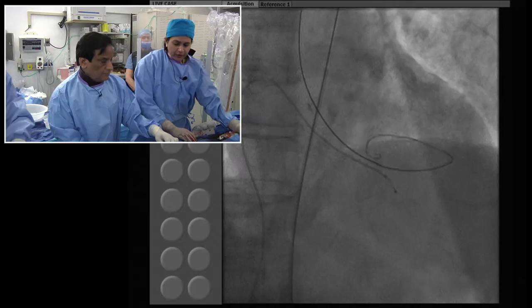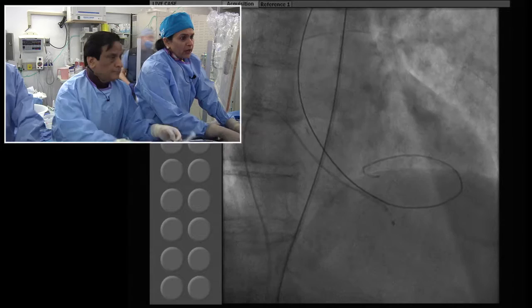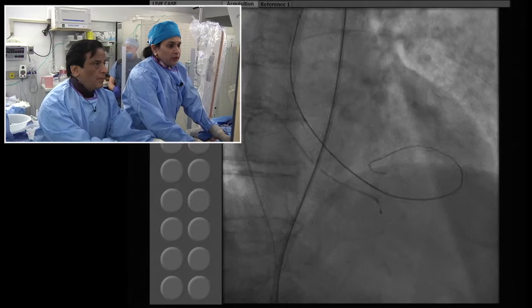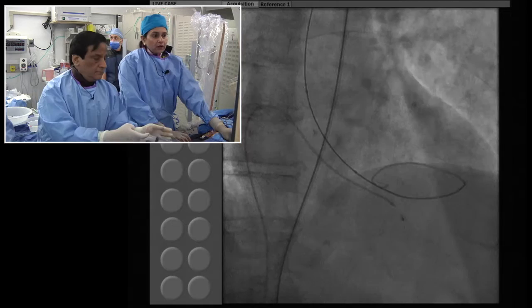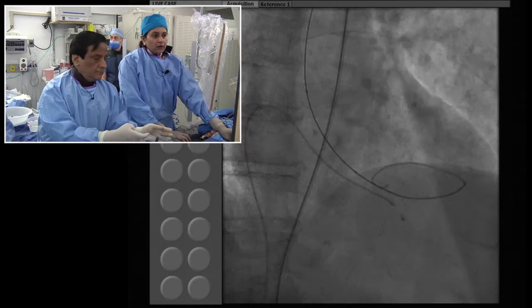Another reason is that in the majority of cases during valvuloplasty, there will be transient hypotension, which could be troublesome if you have already placed a stent in the left main. And most of these we would like to do in the same sitting.